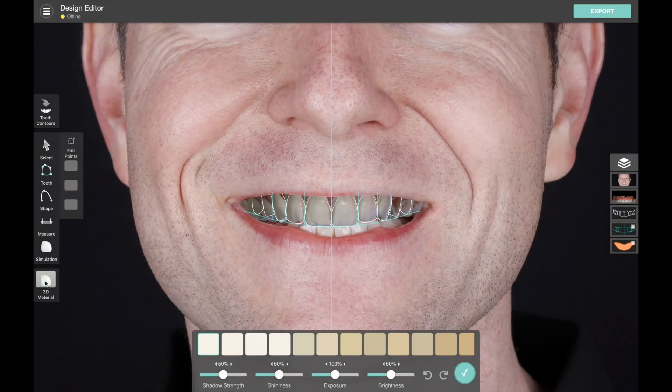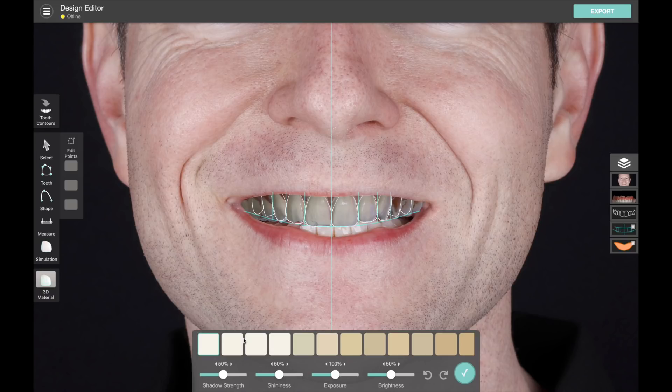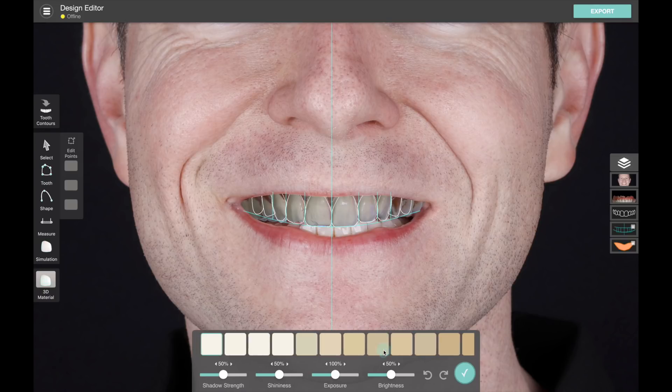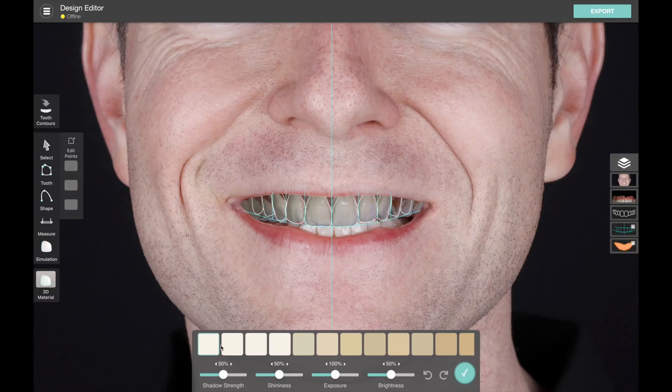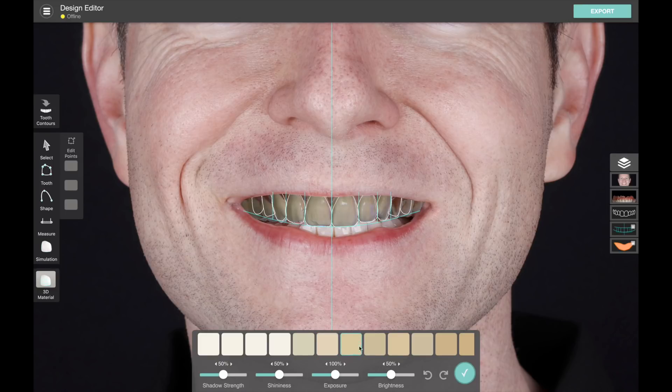So now in the 3D material panel, you'll see there are a bunch of sliders and some shades. These shades aren't true calibrated shades, but they just influence the teeth a little bit. So if you want to be looking at darker or more yellow teeth, you can look at it like that, or you can keep the shade white.